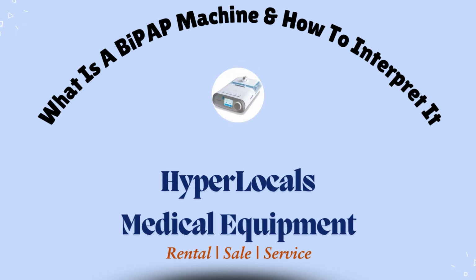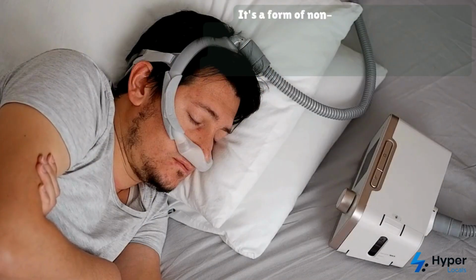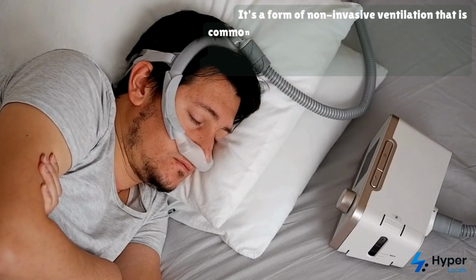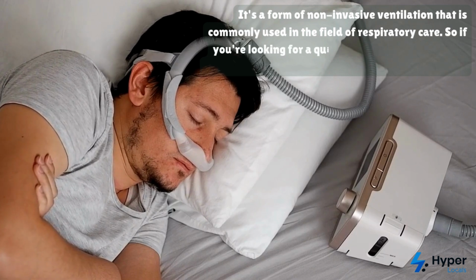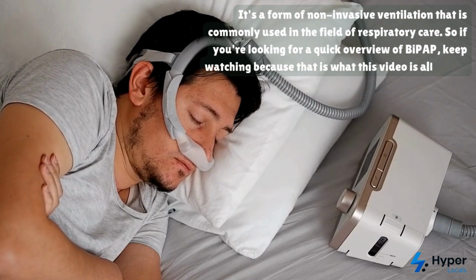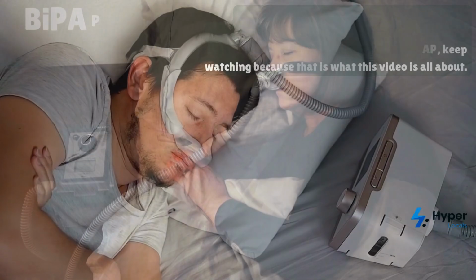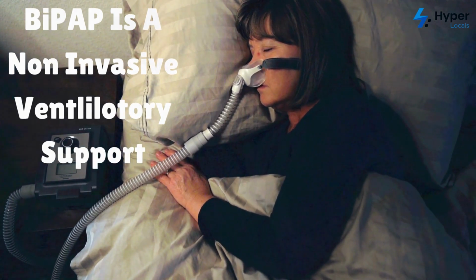Today in medical equipment technology we shall cover BiPAP. BiPAP stands for Bilevel Positive Airway Pressure. It's a form of non-invasive ventilation that is commonly used in the field of respiratory care. So if you're looking for a quick overview of BiPAP, keep watching because that is what this video is all about.